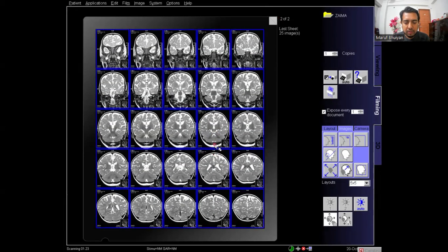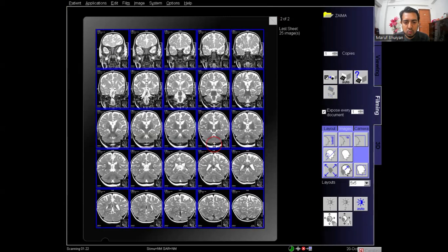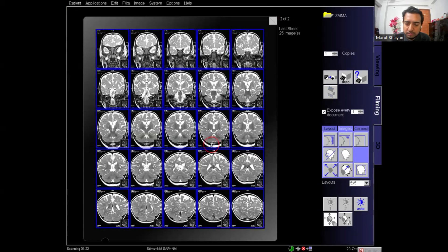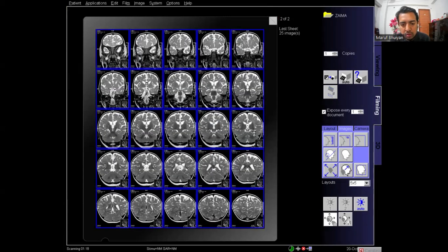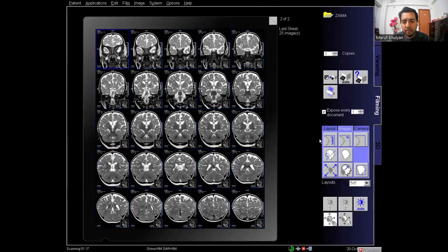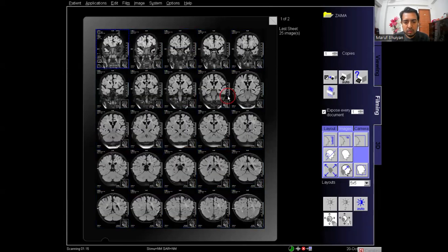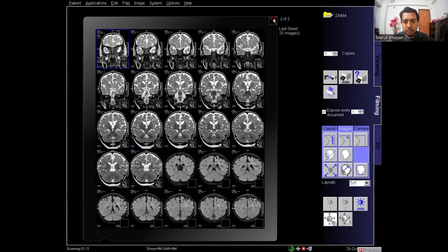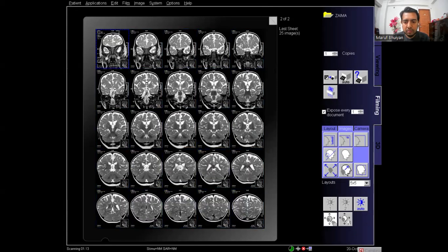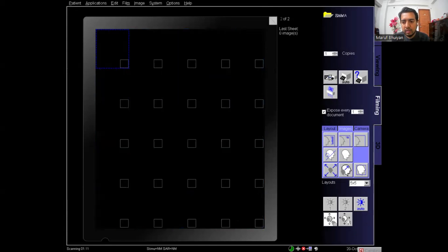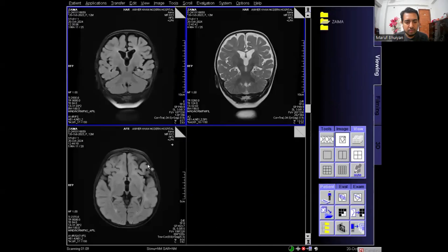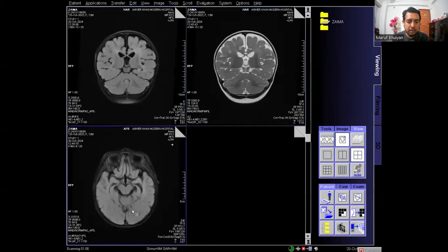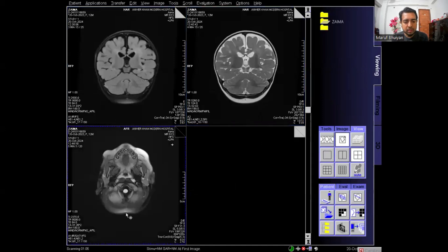I am filming these two coronal series, adjusting the window and zoom pan. After proper filming, click Print or Expose Film to print. Now I will print the rest of the brain series.